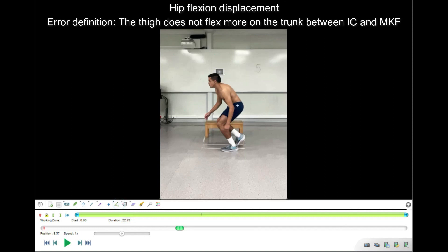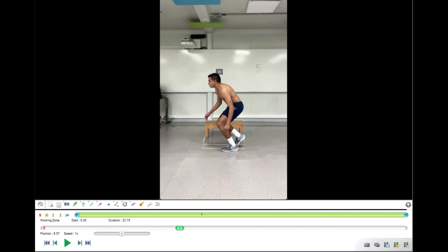I do the same for the hip joint, similar to how it was done at initial contact. I place the cross on the greater trochanter, one dot to the lateral epicondyle of the femur, and the other line parallel to the spine — typically toward the center of the shoulder. The hip angle at maximum knee position reads 98 degrees. Subtracting the hip angle at initial contact from 98 degrees gives the displacement. If the displacement is greater than 0 degrees, there is no error. In this case there was some hip displacement, so no error.